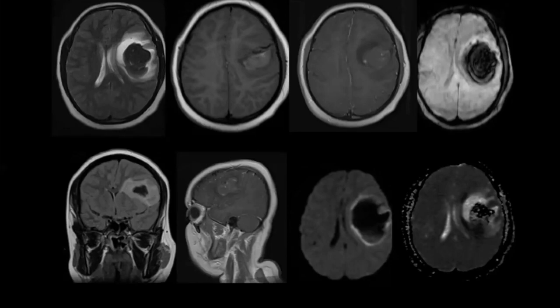So can you explain the sequences to me one by one? Yes, ma'am. The most left one in the first row is T2 weighted image. Sorry, you said correctly. This is acute. It is isointense on T1 and dark on T2. If it had been hyperacute, it would have been bright on T2. So you were correct.